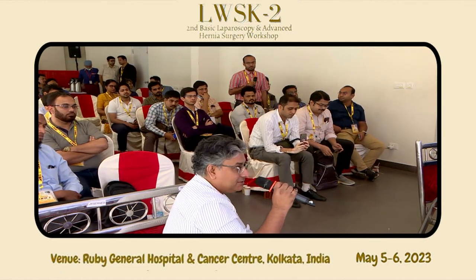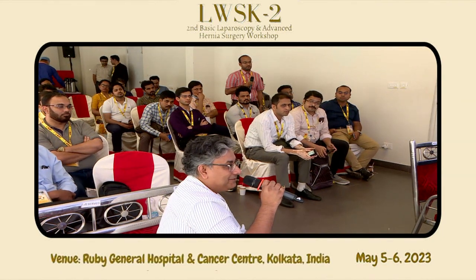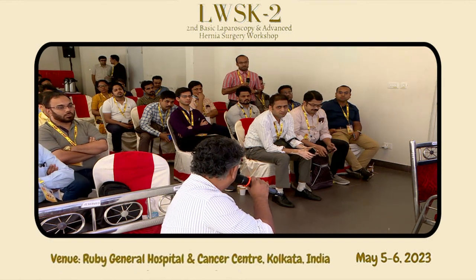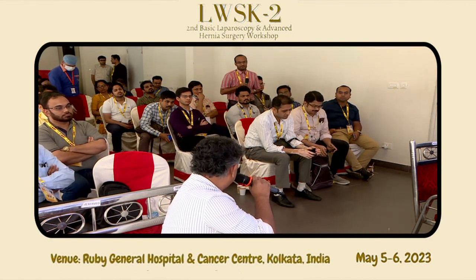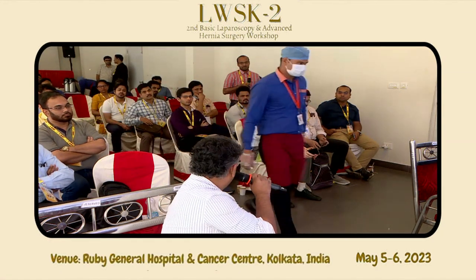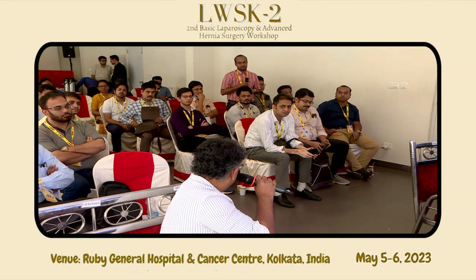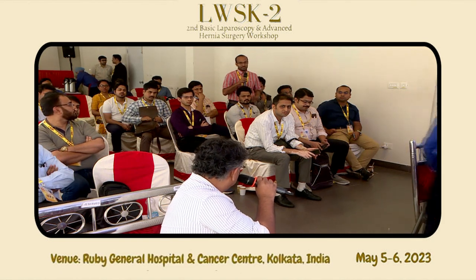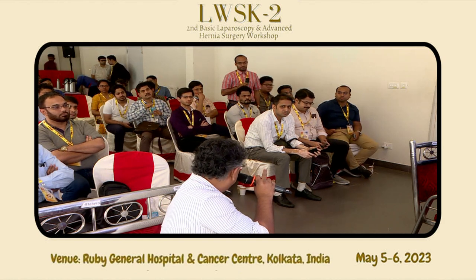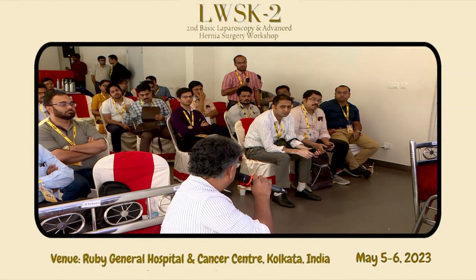So this was in MICCon 2023 when I had that difficult obstructive ventral hernia session, in which they showed pictures of very scary looking obstructed ventral hernias. And they kept asking me, what will you do? So I kept on answering that I'll put in a scope and see. Most of the time, you put in a scope and put in the gas, and the hernia reduces by itself. Correct. So the better thing is always to just put in a scope and see, from a part of the abdomen where you know there's nothing, and maintain the quadrant and the triangulation.